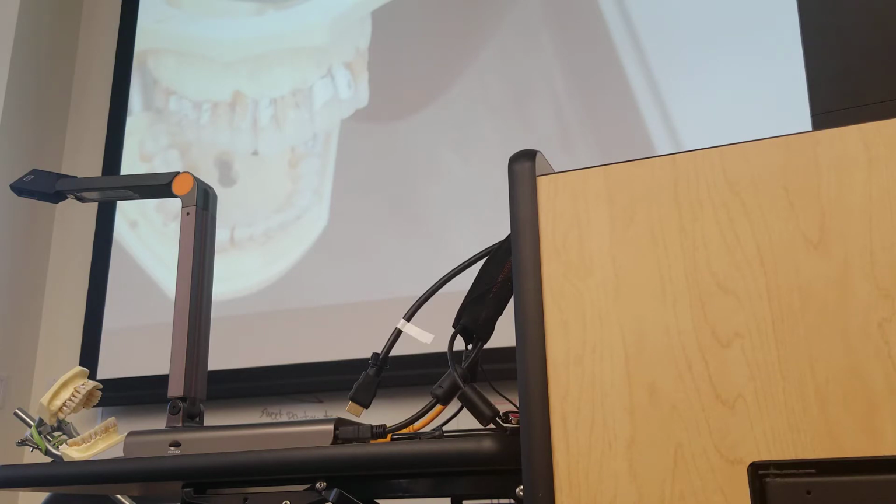Do you have tissue? And then make sure you start. Say that this is the midline, you're going to start just right there. What you want to do is overlap the other, so now when you do the other side, it's on this side.